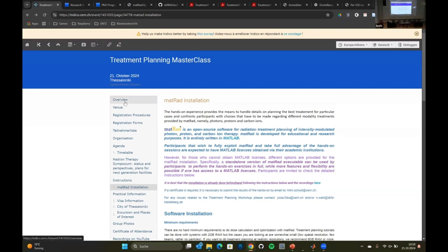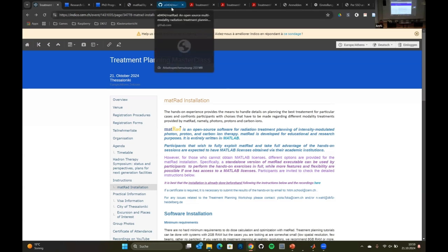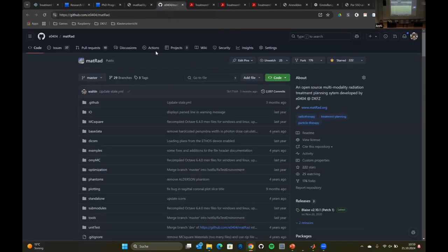There's a question about the helium update. When might be the next release with the helium update? There are already some people very eager to try something out, for example, the helium. I can show you something. If you are on the GitHub, this is our GitHub page, and you see that for a long time we didn't have a new release.